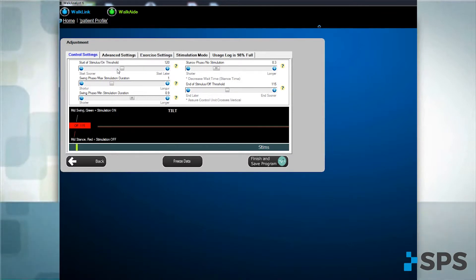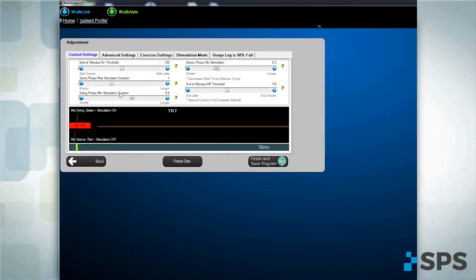Duration. If the stimulation is on for too long or not long enough, adjust the duration of stimulus.